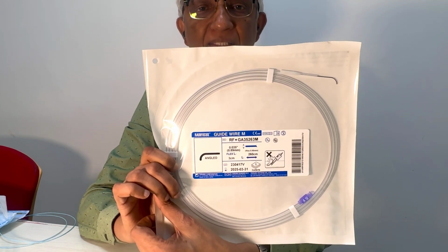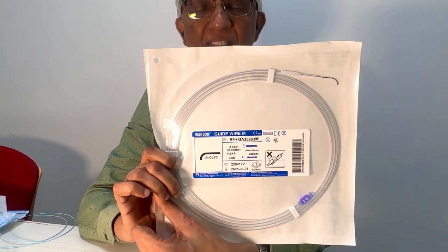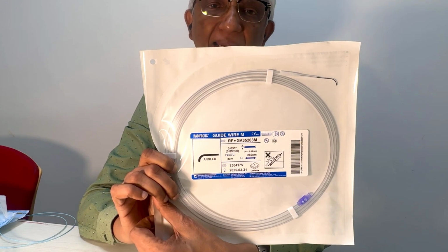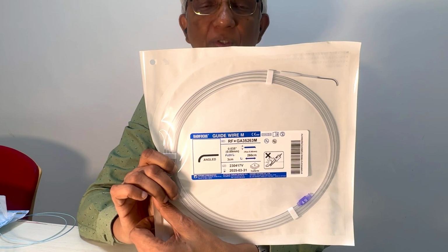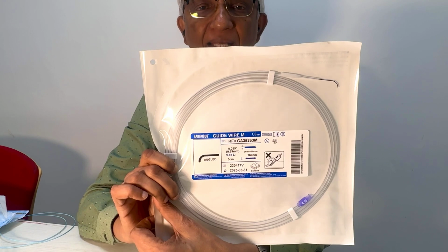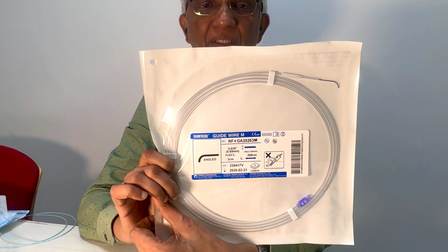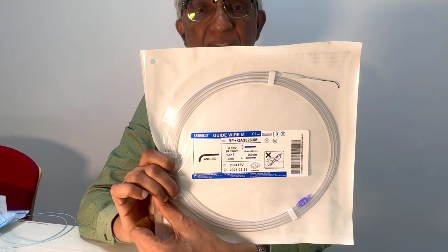So you got a catheter inside the body. The length of the catheter is 100 centimeters. You pull out the catheter. Now you're going to take another catheter, and that is going to take 100 centimeters of length. So you need that extra length to work, because inside the body, 70 to 80 centimeters is going to be inside the body itself. Have you got it?